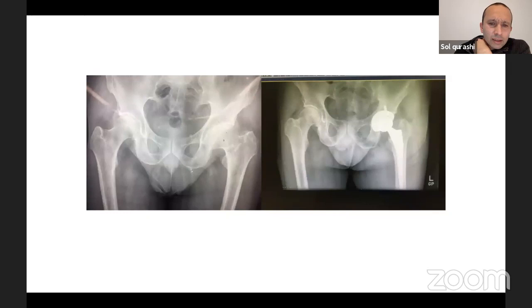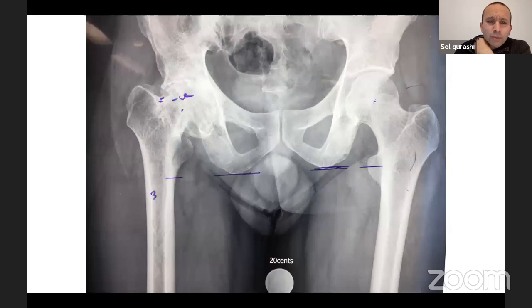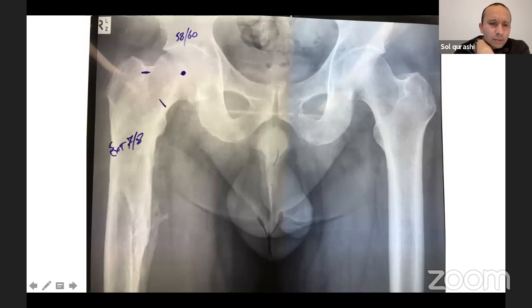Perthes. This was a fairly large cyst in the acetabulum. We were able to graft it pretty comfortably. This gentleman had a fractured femoral neck in the past with a good 3 to 4 centimeters of shortening. And we were able to get him back to length. Had to medialize the cup though, otherwise it would have been impossible to do. Previous fracture, we've done a few of these now with previous femoral shaft fractures, and each time we've been pretty lucky.